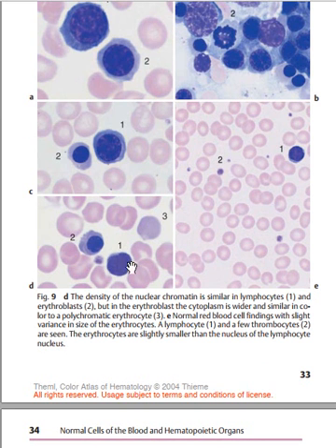So you have lymphocyte and you have erythroblast. You see that lymphocyte and erythroblasts are quite similar, though erythroblasts have a greater cytoplasm compared to the lymphocyte, just to distinguish. So this is actually how erythropoiesis occurs.